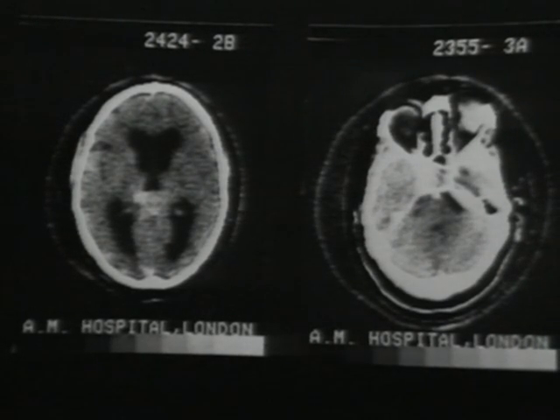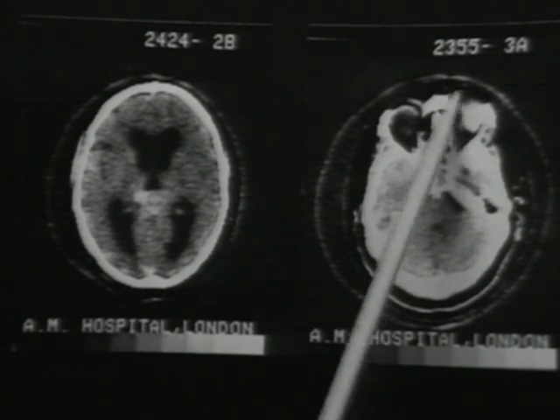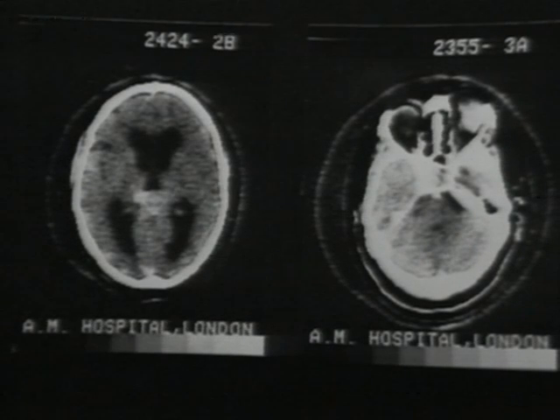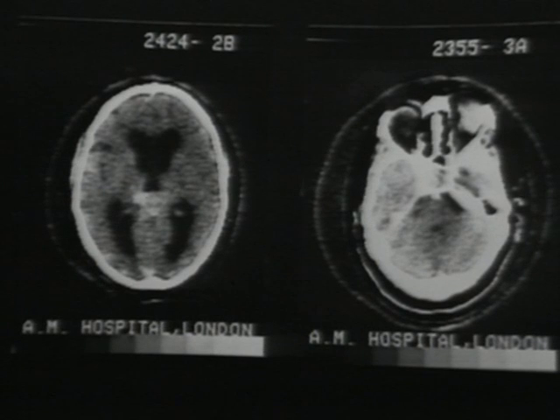On the right side, the situation is altogether different. The optic nerve is straightened and displaced medially, and here in the outer lateral quadrant of the eye you can see a large dense tumor. This is a cavernous hemangioma.